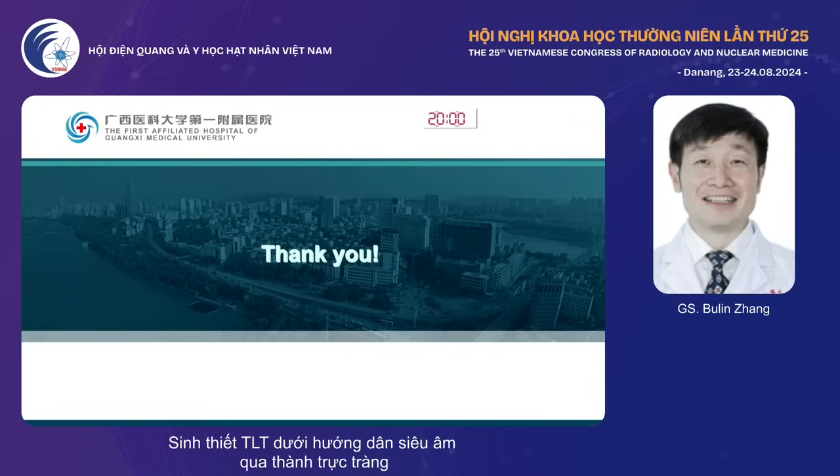If peripheral zone nodules were found on DRE, transrectal ultrasound or MRI, 2 cores will target the nodule, and the other cores will be taken.